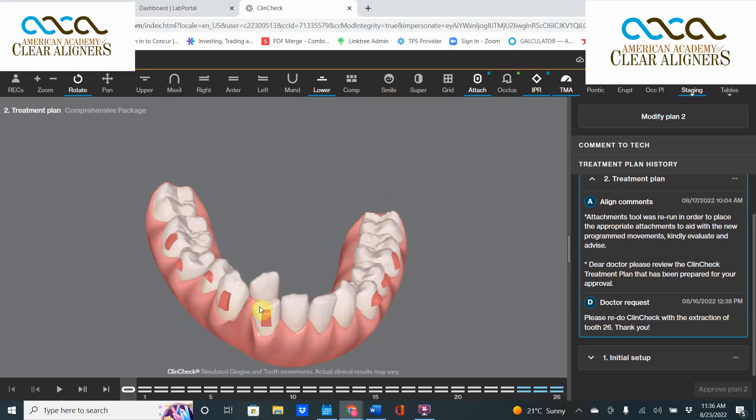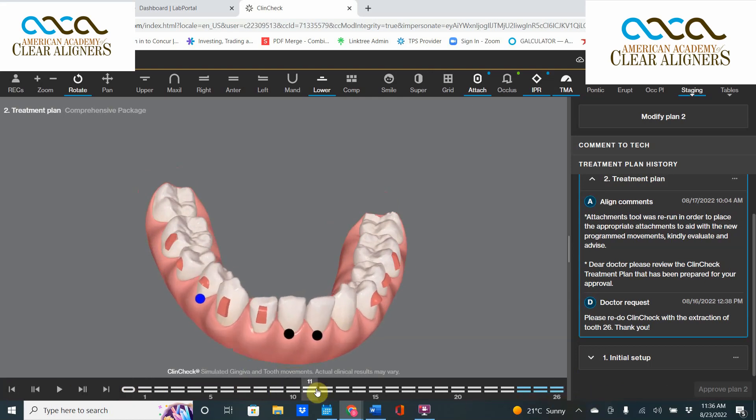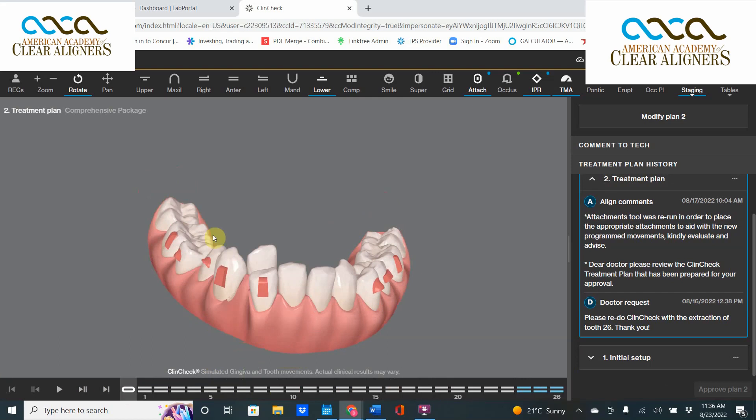So we asked the computer to extract the tooth. The technician goes in after ClinCheck number one, extracts the tooth, and that movement seems much easier, much quicker — with just a little bit of root torque on this central incisor — but I think it can be accomplished.